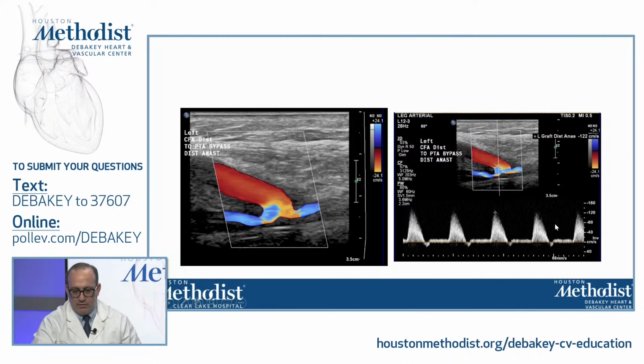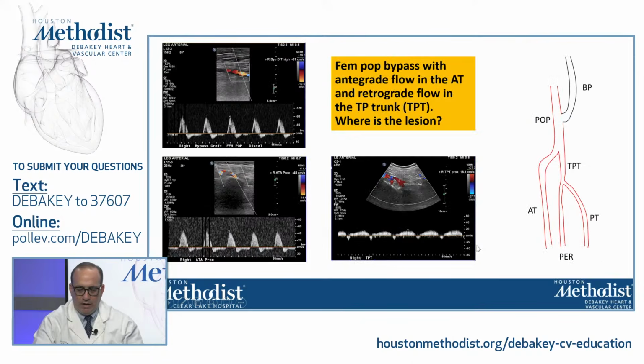And again, this is what we see. There's a little disturbance in flow as you have a big conduit going to a smaller vessel, but velocities are not elevated. And again, here we still have almost a triphasic waveform.